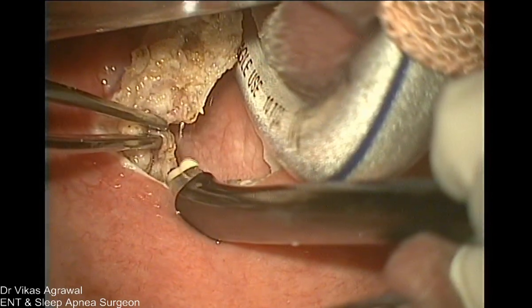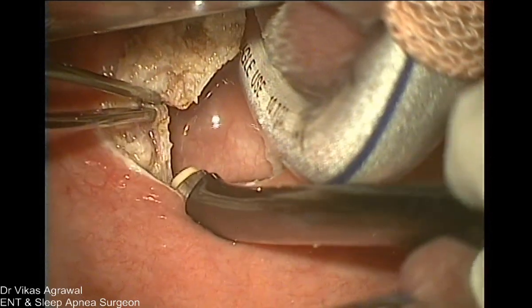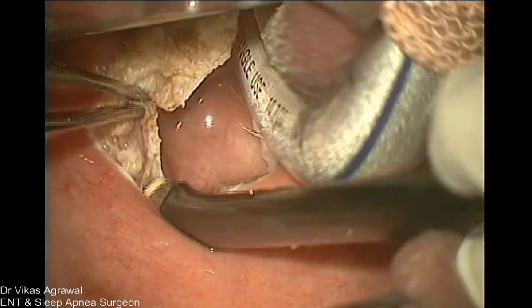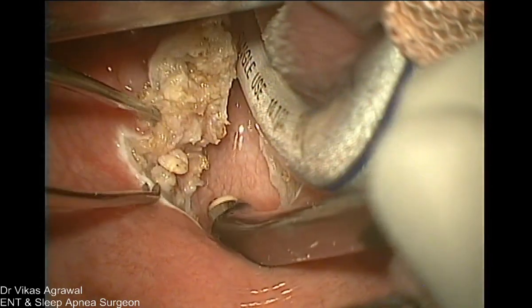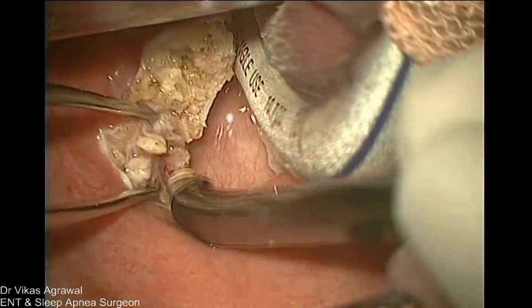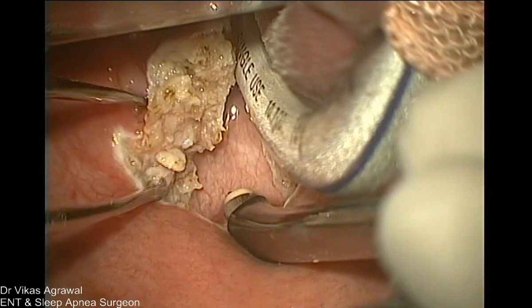Yeah. And that is the worst complication you can ever give, because then even the CPAP will be ineffective. So you have to stop when you reach the lateral pharyngeal wall, which is now. Right? Right. This is almost a 90-degree cut. Now see how much of the soft palate is out. And there's a lot of space created here.